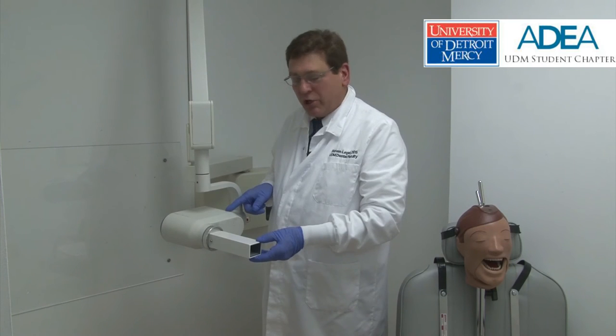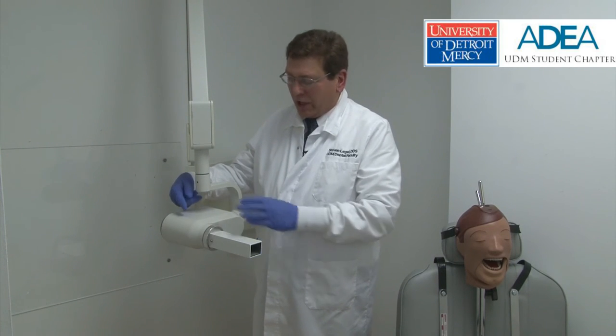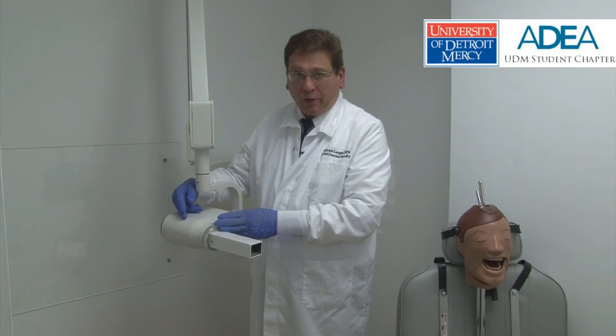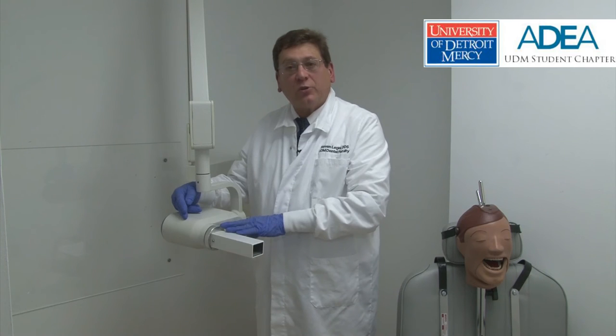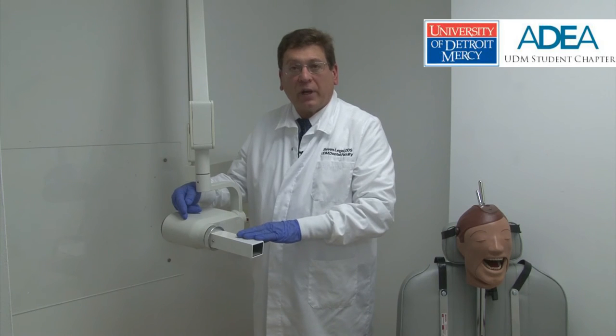Inside the head, the radiation is produced when electricity jumps from the cathode to the anode. The electrons inside the head have no brain. They bounce around and scatter randomly until they find their way out the window into the collimator. You may have seen the way lottery numbers are picked. The random ping pong balls bounce around until they find their way out the opening. The electrons do the same thing here. They bounce around inside the head until they find their way through the window and out into the collimator.